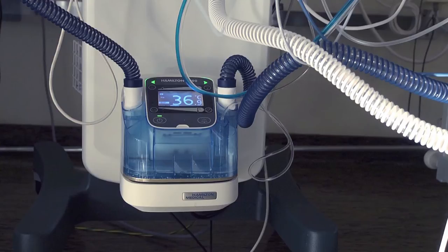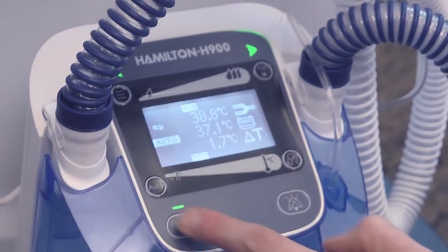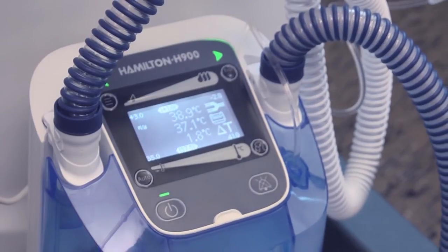Each patient has individual needs and environmental conditions vary. That's why the Hamilton H900 allows manual adjustment of the temperature and humidity settings. We are now in a much better position to react to a patient's needs or even to environmental influences.